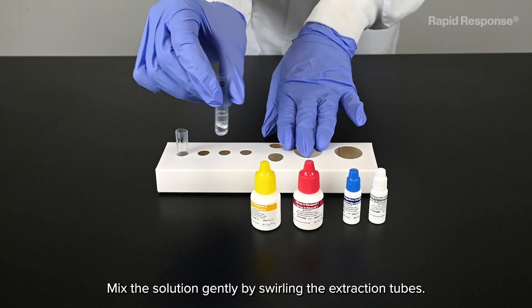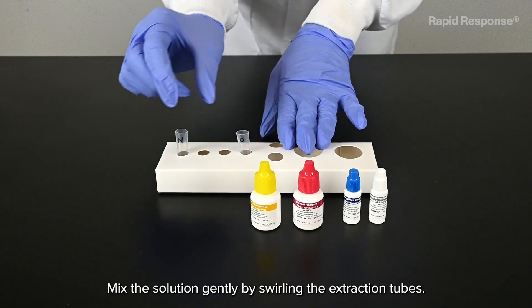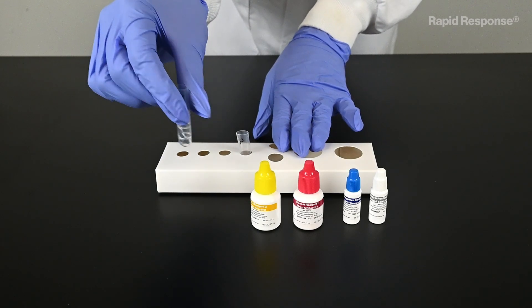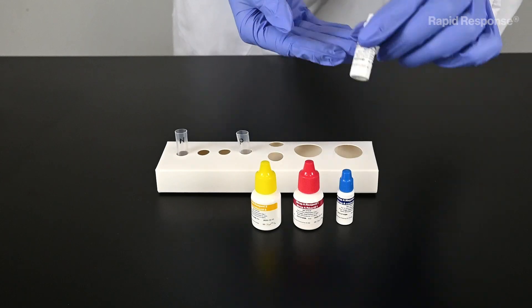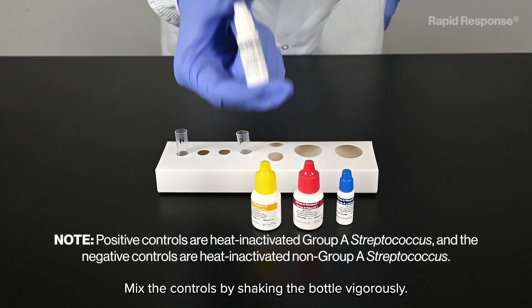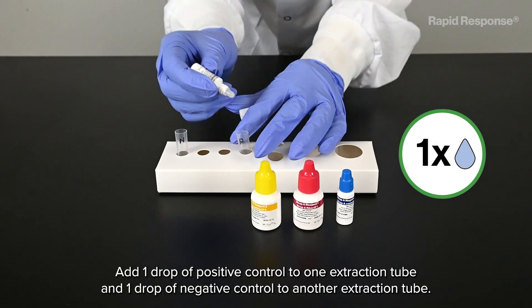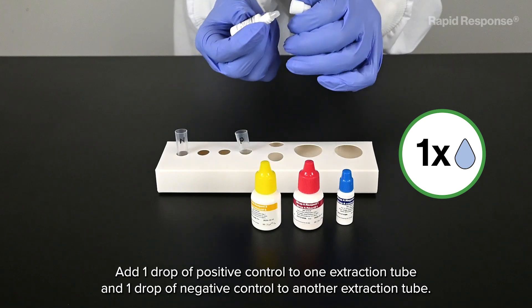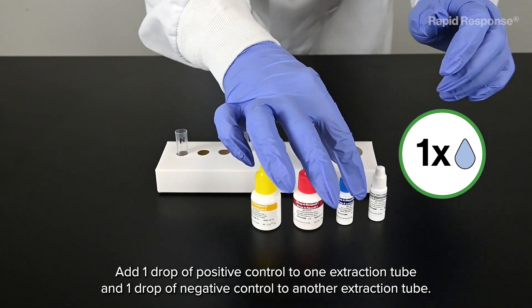Mix the solution gently by swirling the extraction tubes. Mix the controls by shaking the bottle vigorously. Add one drop of positive control to one extraction tube and one drop of negative control to another extraction tube.